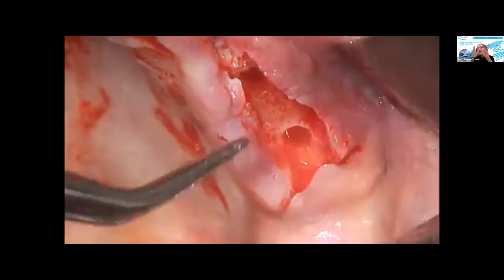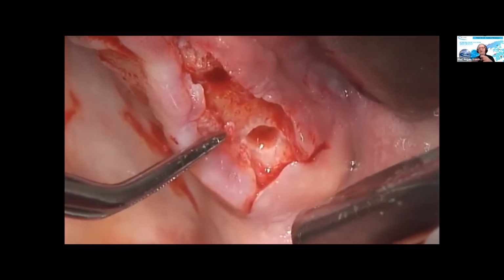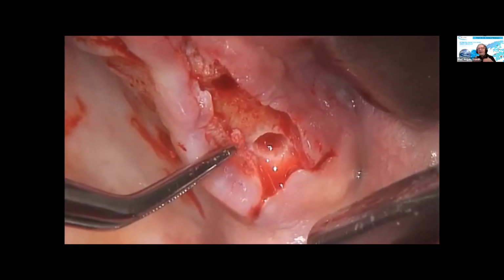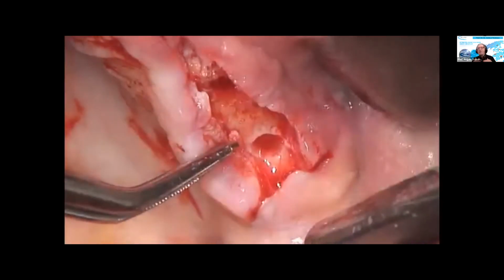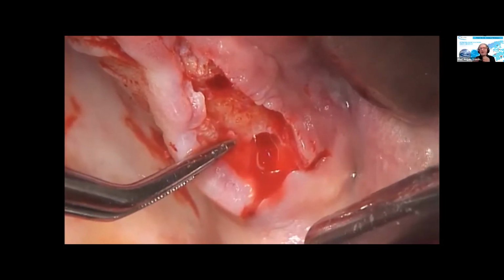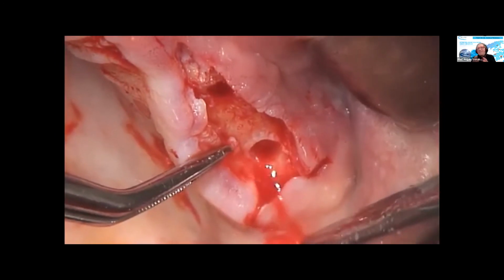You simply do the Valsalva test, but be careful. Don't close the nostril of the patient. Mostly you can see it by the breath synchronous movement and by the outflow of the saline solution you pumped in between. So this is your control.